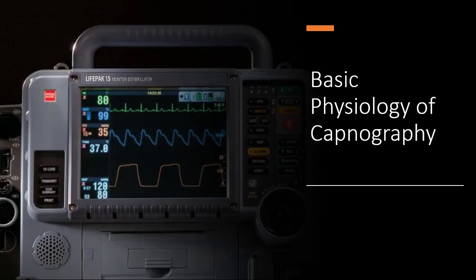So let's talk about the basics of capnography. When we look at the word End-Tidal CO2, let's look at the CO2 part. What is CO2? Well, it's carbon dioxide, of course, but where does it come from? Does it naturally appear in the air and we just happen to measure it? No, it comes from the respiratory tract.